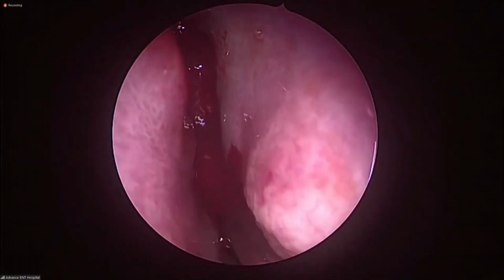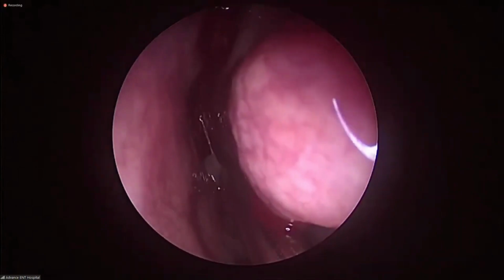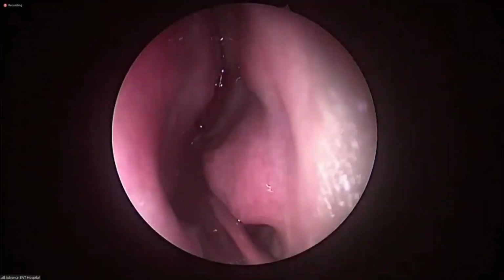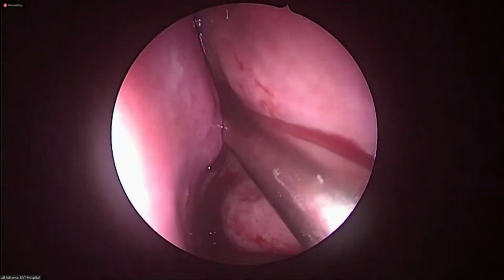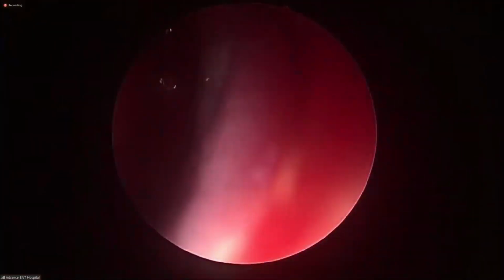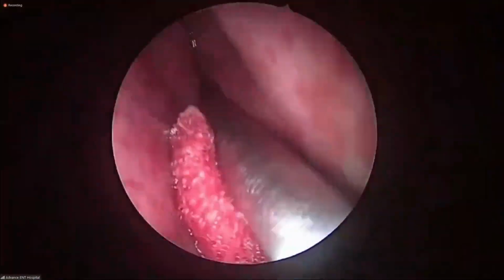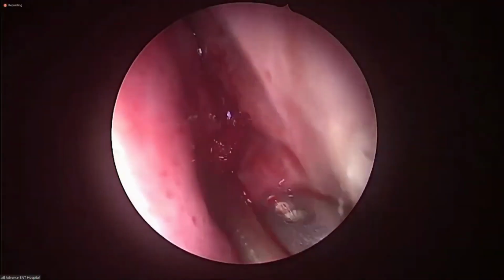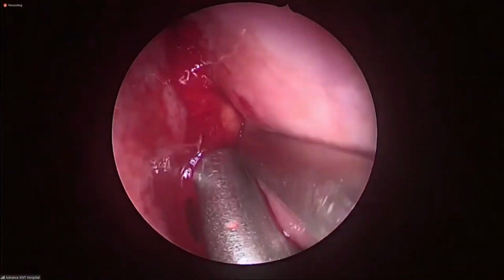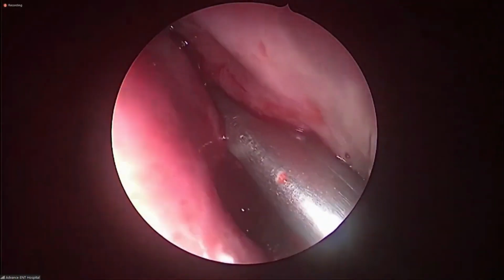See? Oh, the situation is challenging. A lot of infected polyps, no visualization inside, deviation significant. See, these are angry polyps, pure inflamed polyps. So it's a hurdle race, sir.